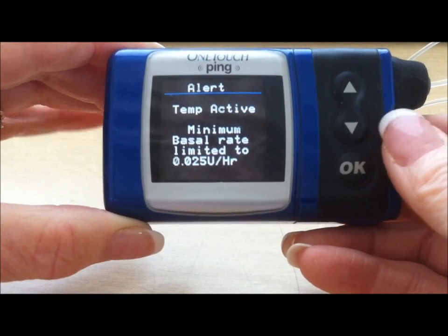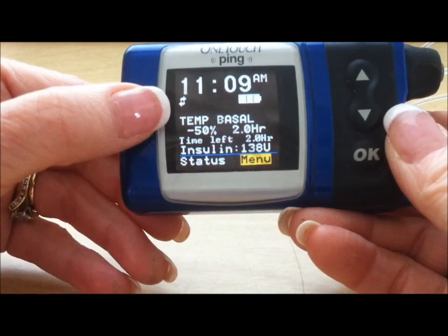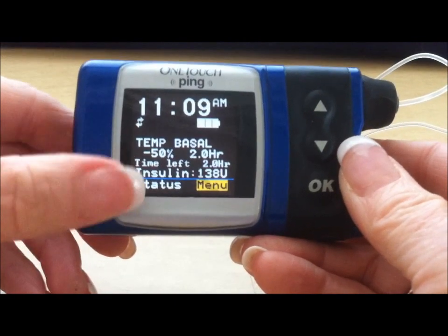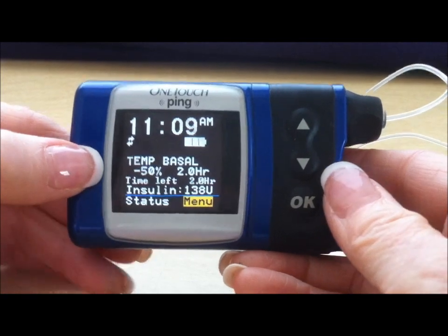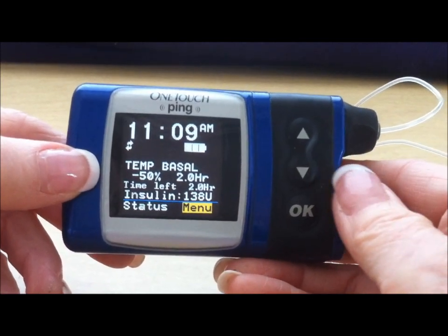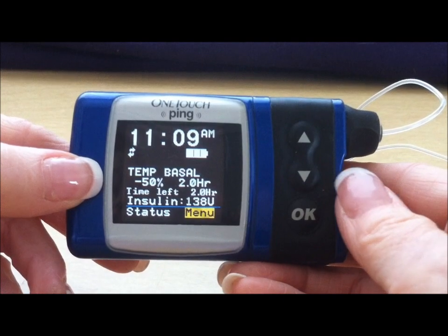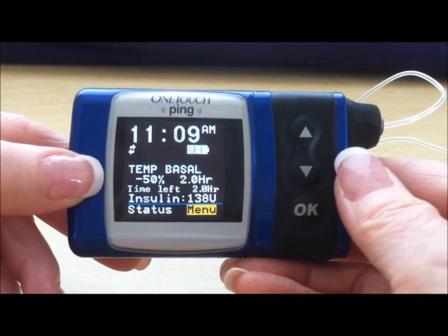It reminds you that there's a minimum limited rate. When you go to your main menu, it will say there's a temp basal of minus 50% for two hours and that there are still two hours left in this temporary basal rate. The convenient thing about a temporary basal rate is this two-hour timeframe will continue to count down, and at the end of that two hours it will kick back into your regular, normal, usual amount of basal rate.